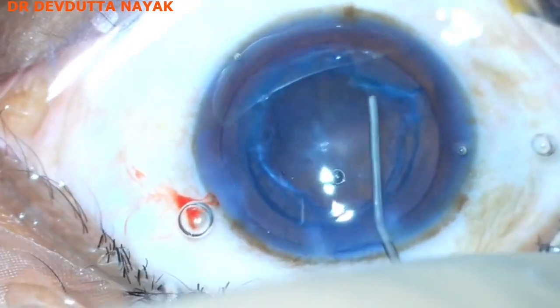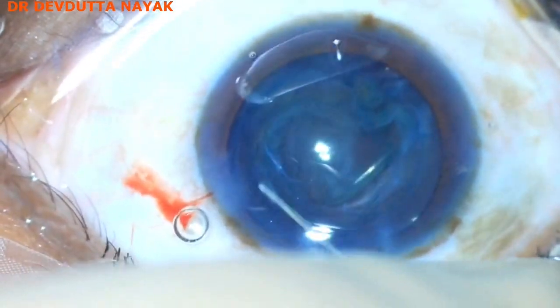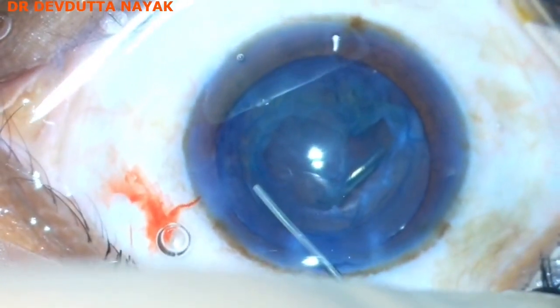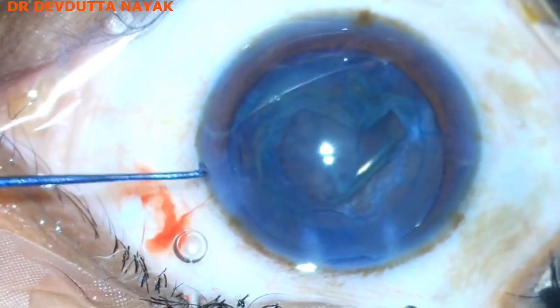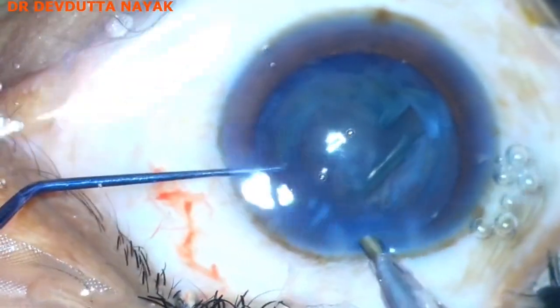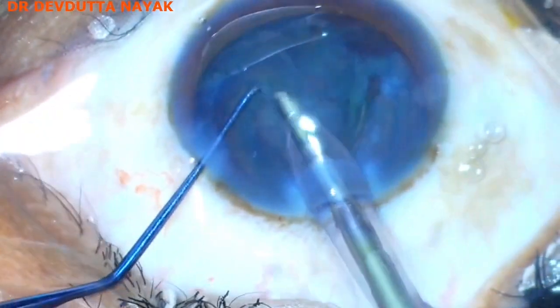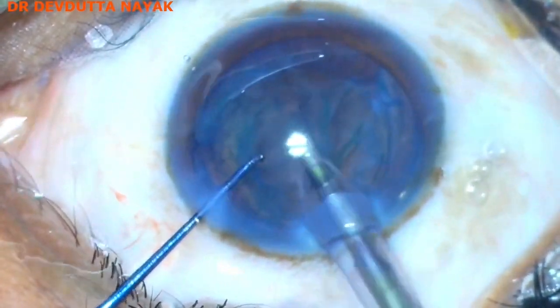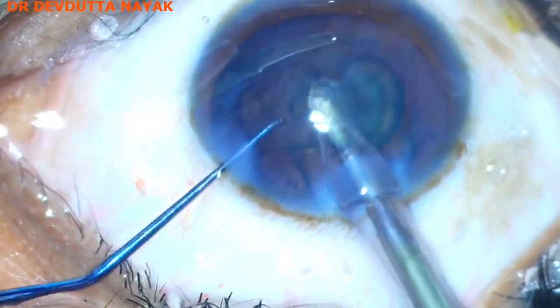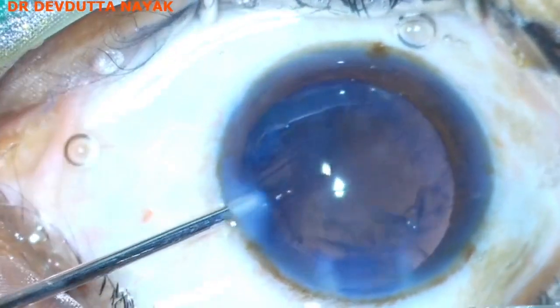Now the nucleus has been totally emulsified and removed. We can see a thick epinuclear plate, so I proceed to do a second hydrodissection to loosen the epinuclear plate, then with the help of the phaco probe I aspirate the epinuclear plate using vacuum only.